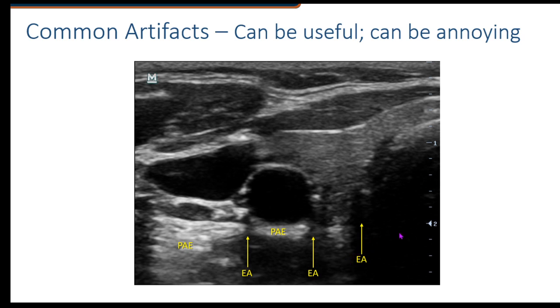We can't leave out posterior acoustic shadowing. This particular trachea does use up the sound beam — we're hitting the cartilage and the air scatters the rest, so there isn't enough energy to continue and we get a deep shadow underneath. We also see some attenuation from what happens to be a thicker piece of collagen or connective tissue within the sternocleidomastoid.